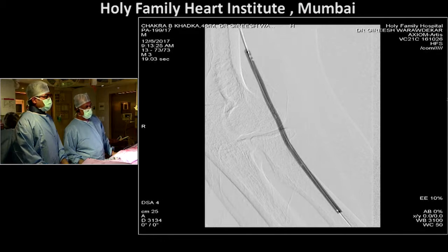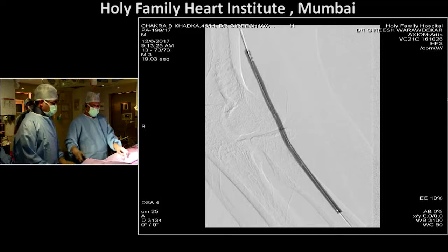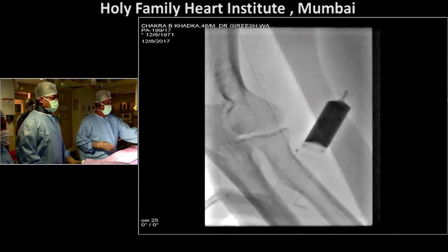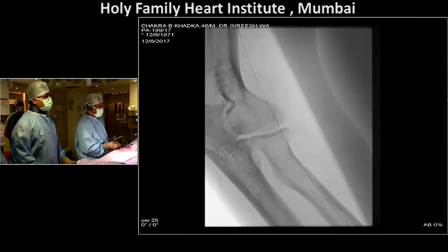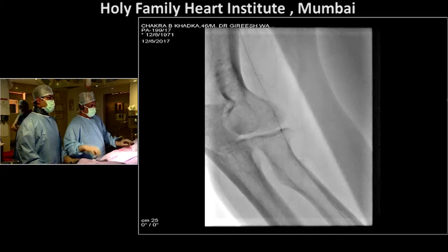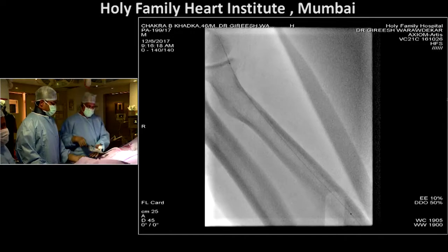I would like to ask him, now that AngioJet has just come in, what would be the role of AngioJet here? That's a very good question. We are using AngioJet both in the periphery and the coronary for organized thrombus in very large vessels, 4 to 5 millimeters or greater, because it emulsifies the thrombus and evacuates it. If you dilated this and found a large organized clot, and despite your anticoagulation, which here I guess you've gone from Lovenox to heparin, you still had trouble, then that would not be an unreasonable option with a 7 French device. We might use it 4 or 5 times a year, but in those cases there's nothing else that would have worked. So it's really for refractory large clot burden.